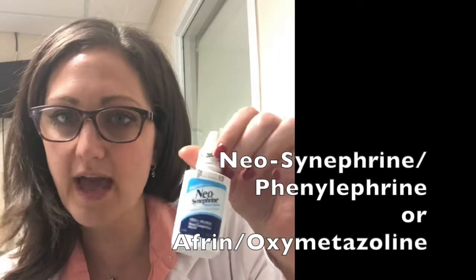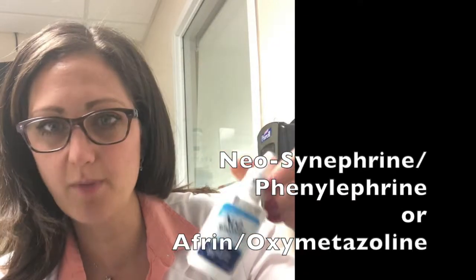I'm Martha Roberts and I'm going to show you the 3-2-1 trick for stopping epistaxis. What you're going to need for this particular 3-2-1 trick is simply a bottle of neosynephrine or Afrin, depending on what you have in your department.